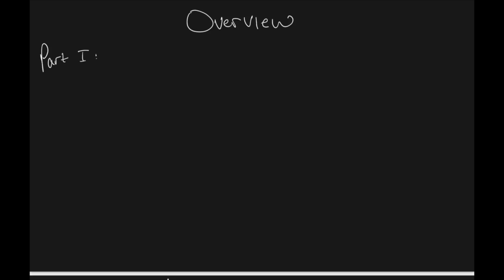In the first one, we are going to discuss the normal variants that can be found on a 12 lead and how those changes can become pathological. In the first part of the video, we are not going to talk about why those changes are present. We're going to save that for the third video. We're just going to reassure ourselves that we have the tools necessary to be able to point out what is abnormal on a 12 lead.